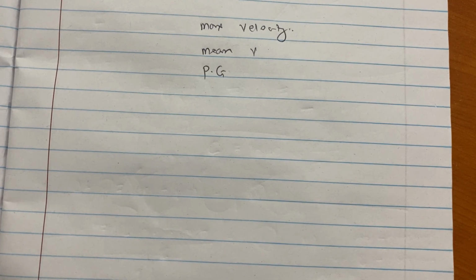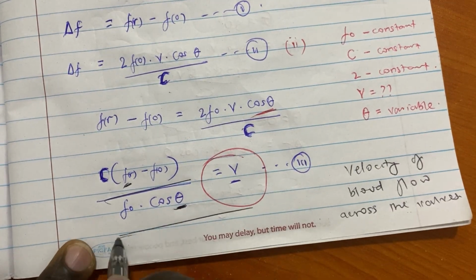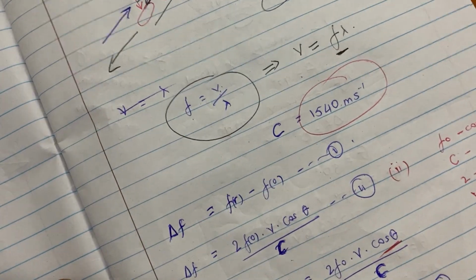Why we do Doppler is to measure velocities, as I showed in this equation 3. Don't forget. Thank you so much. Very basic. Once you know it, you will be good. Yeah, I'm done.